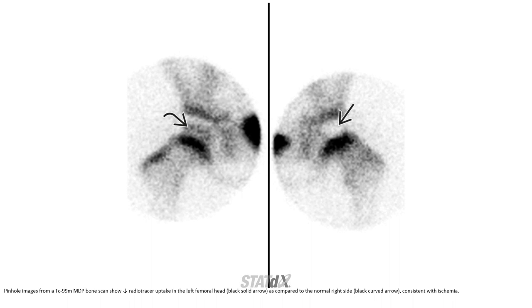Pinhole image from a Tc-99m MDP bone scan shows decreased radiotracer uptake in the left femoral head as compared to the normal right side, consistent with ischemia.